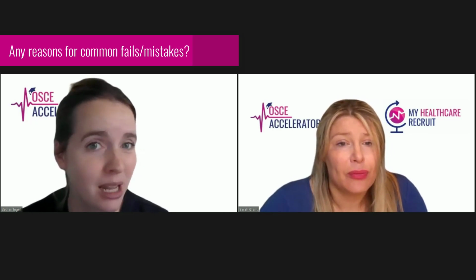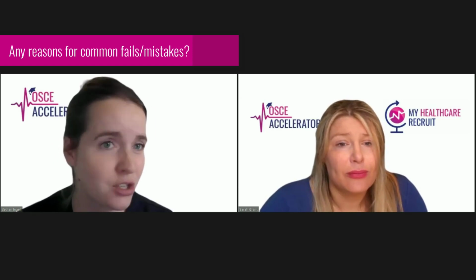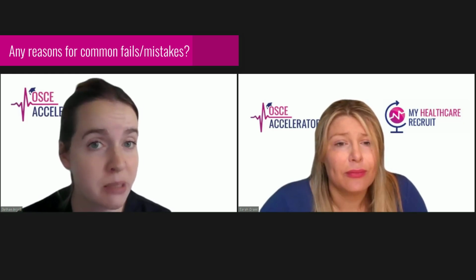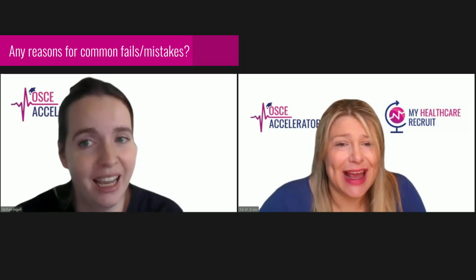Not recording your results, it's a simple thing, but if you leave them all to record afterwards, you're going to forget and make a mistake. Just do it as you go. Also getting confused when you're explaining the technique to the patient and maybe making some errors with that. So almost practice that communication again and again.